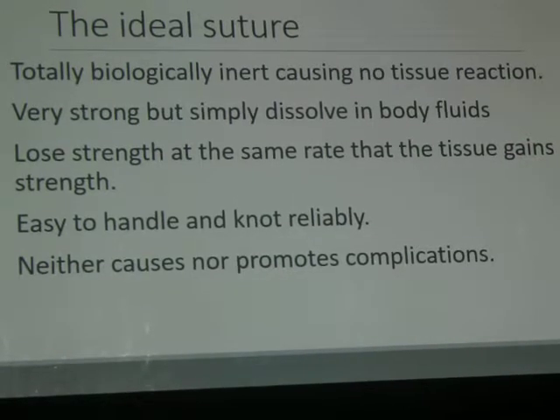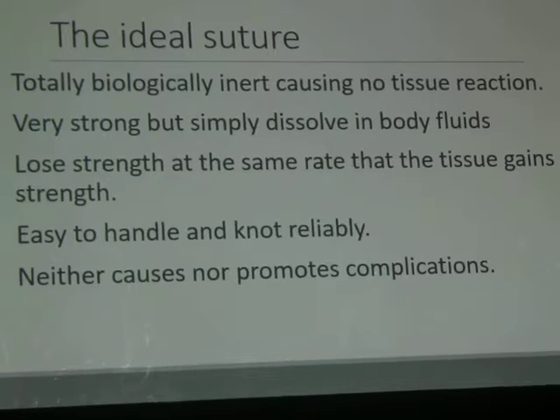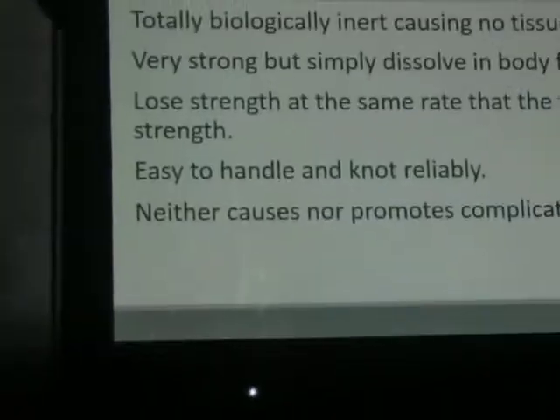This ideal suture does not exist. وعشان كده هنلاقي ان في huge range of suture material هنتكلم عليه دلوقتي، ولازم احنا كجراحين نختار الحاجه اللي تناسب المكان اللي هشتغل فيه.